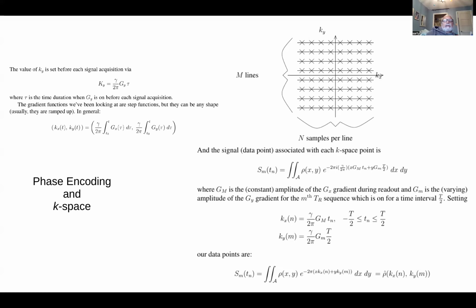So this particular scheme I have here is a mathematically convenient one. When you do Fourier transform, it avoids problems at the ends of the frequencies. So there's two issues here. One is the application of the fast Fourier transform.